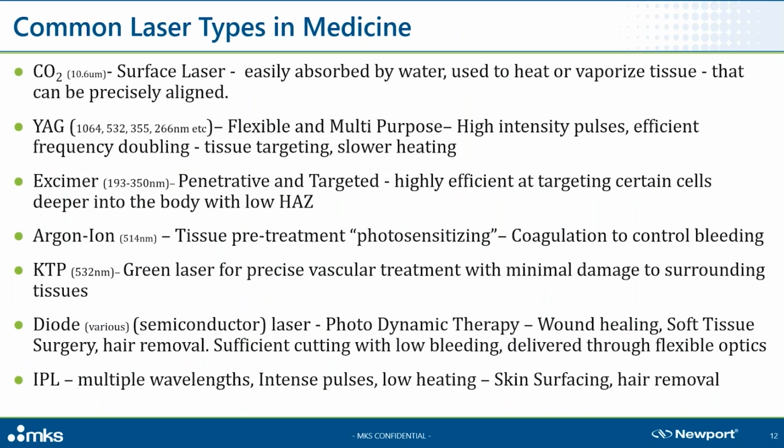Lastly, I included the IPL. While technically not a laser treatment, this emits intense pulsed light at multiple wavelengths that scatter and penetrate the skin at various depths. The IPL is effective for treating a broad range of skin conditions.